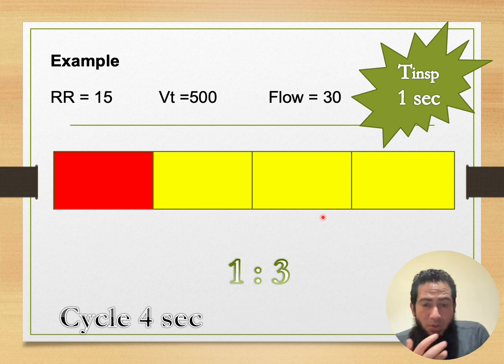Most of the ventilators offer a post-inspiratory hold just after the inspiration. The volume, for example, will be kept in the lungs for a certain period before opening the valve and allowing exhalation or expiration.